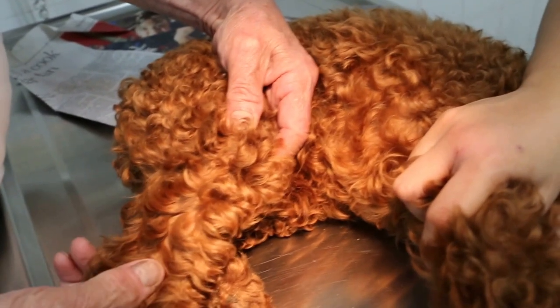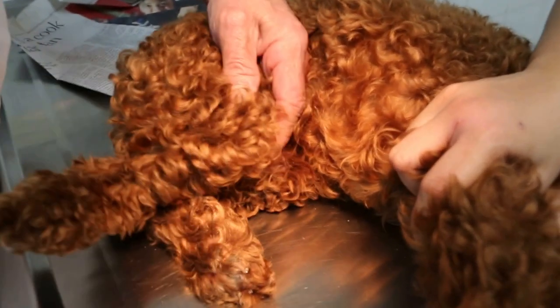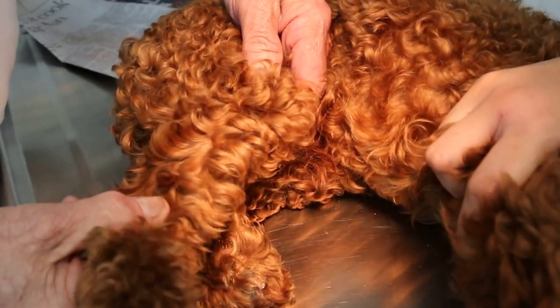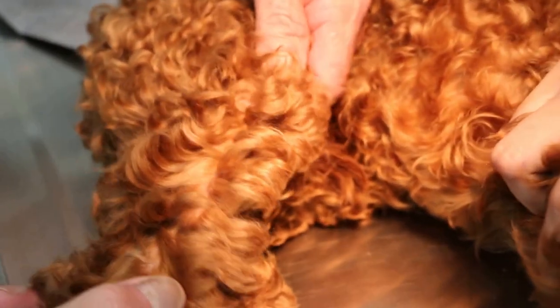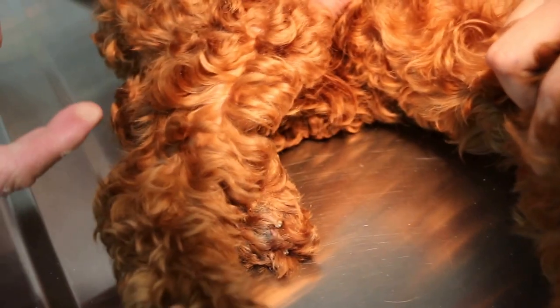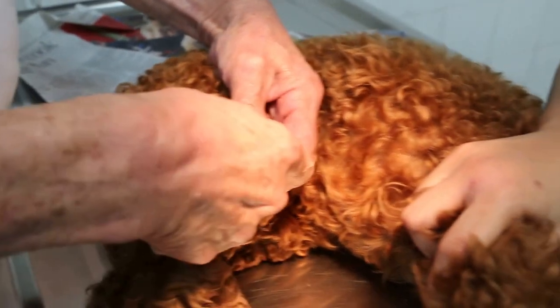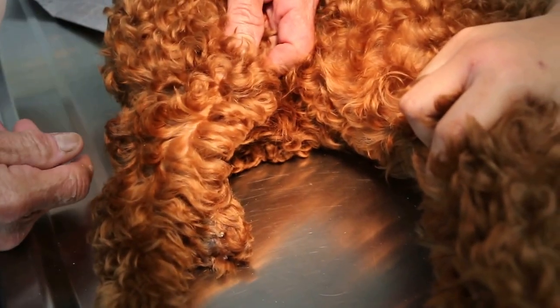Then the whole leg is twisted. Now that's normal. Let's see, come out again. Yeah, lateral luxation. Now it's normal. So you have to do surgery, you go and fix up the patella, and then everything is over.